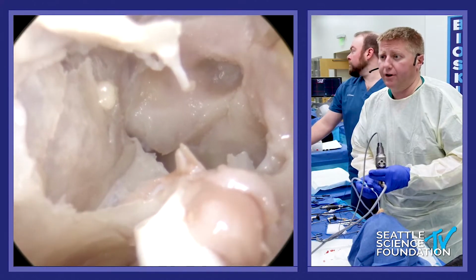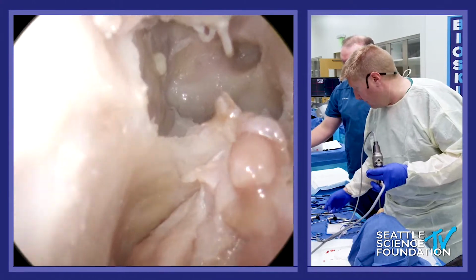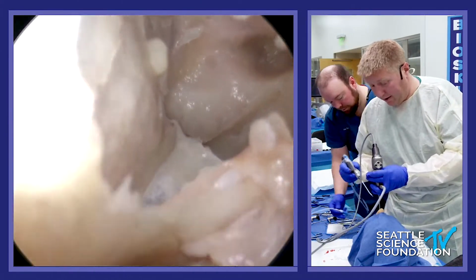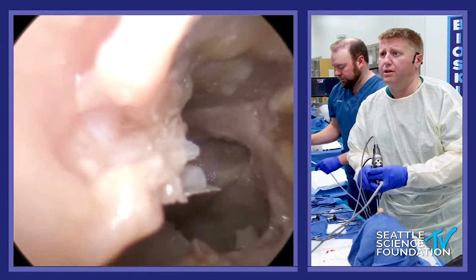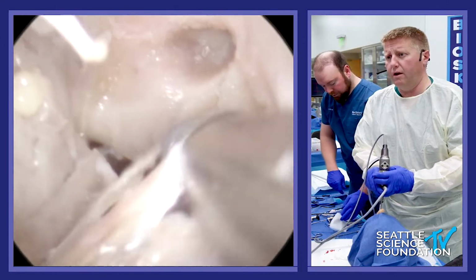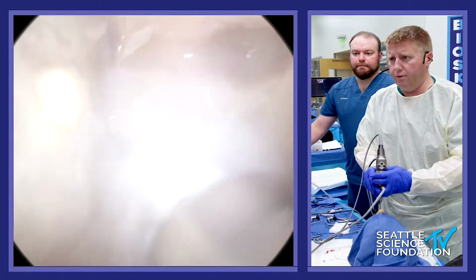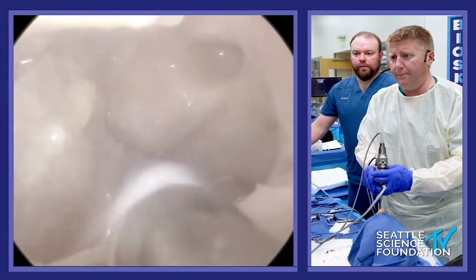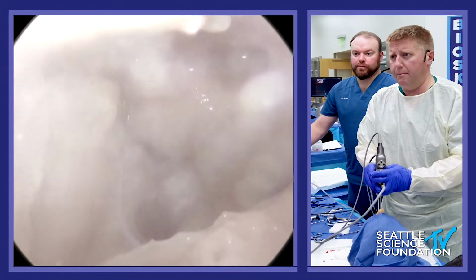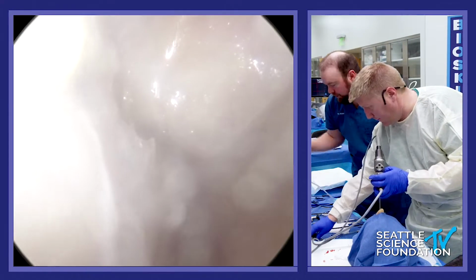And while we might have good access to that through here, remember, this is going to be 2 surgeons and it's going to be 4 hands. You're going to need to get access for somebody else through the other side. So at this point, what we would do is lower that face of the sphenoid. And you can do this a lot of different ways. You can do it with a drill. You can do it with a curette. If you're doing it with a drill, just be aware of where your flap is and make sure it's down and out of your way. Now, once you've got better access for that, suction.